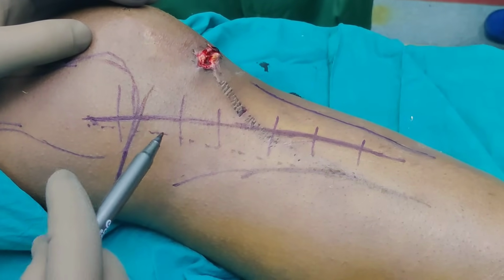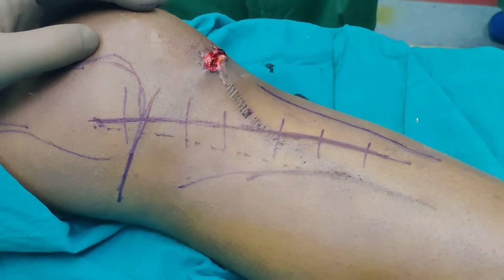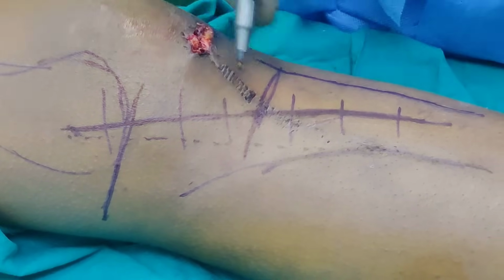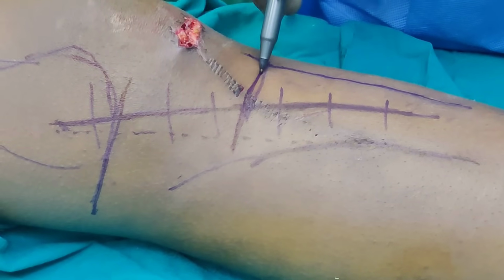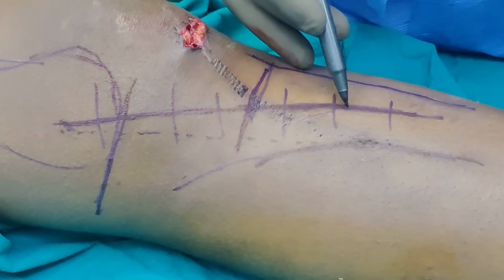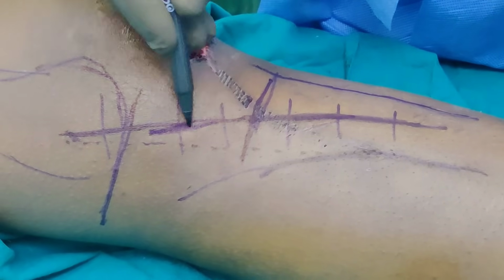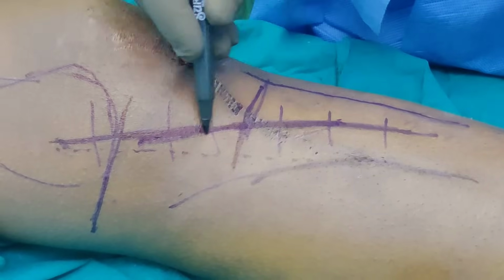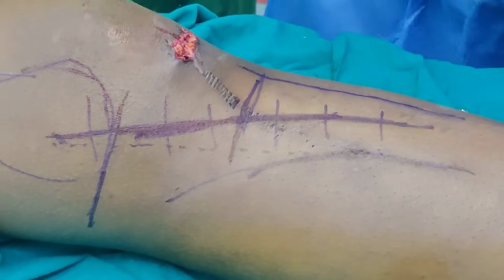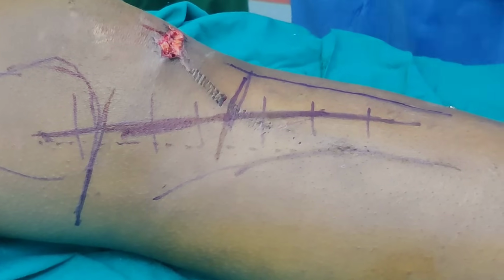So I'm just going to C-arm shoot, see where the apex is, and decide my length of incision. So we have looked at our C-arm and our fracture line. The apex of the fracture is somewhere here. So I don't think I need to be more distal than this. So I'm just going to use this much incision, and if I'm struggling, I can always extend it more. So you can make your incision bigger, but you cannot make your incision smaller. So let's start with the skin incision.